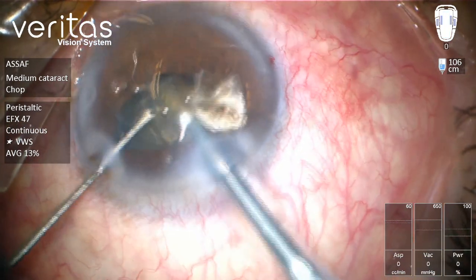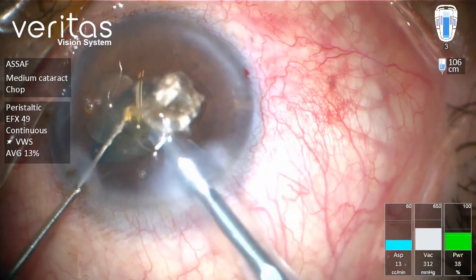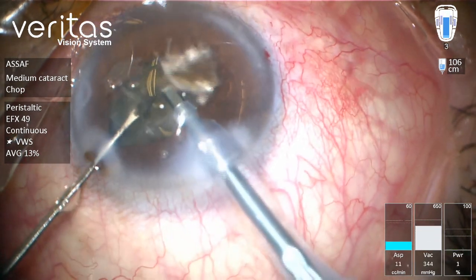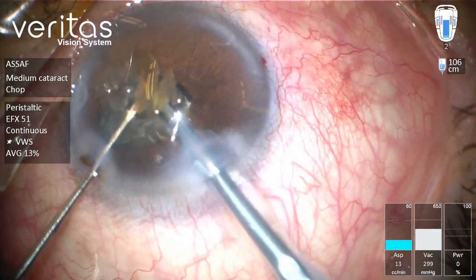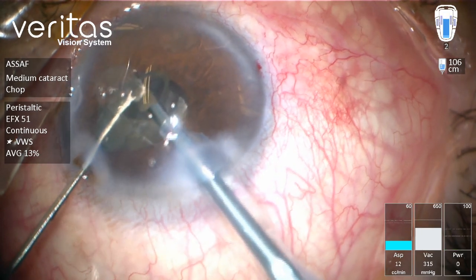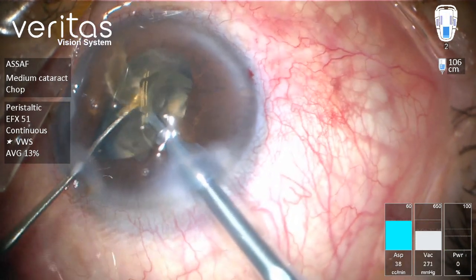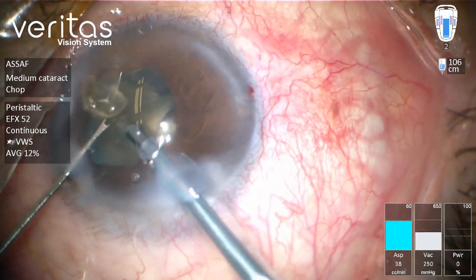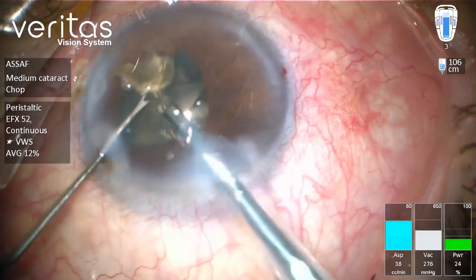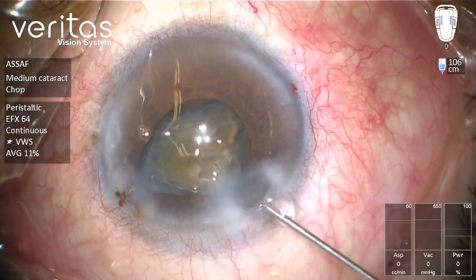In this area we have to challenge ourselves by working in the central part of the anterior chamber and capsule. We don't have too much room to manipulate with the phaco tip, so I'm keeping the phaco tip in the central part at all times without too much manipulation. There is probably more work for the non-dominant left hand using the second instrument to inject some OVD.